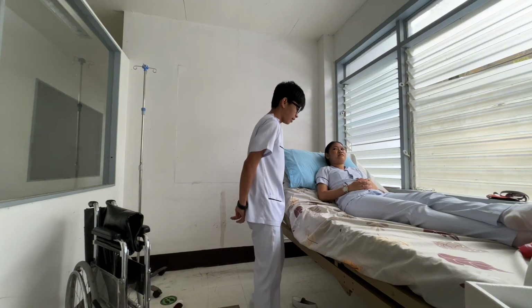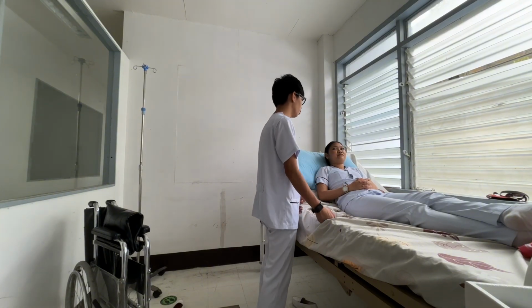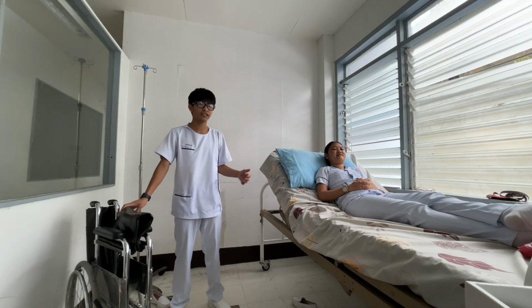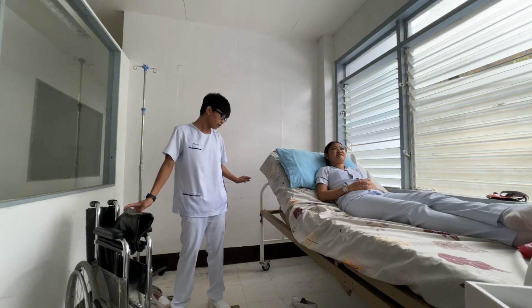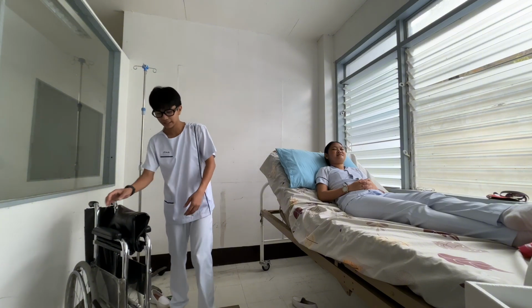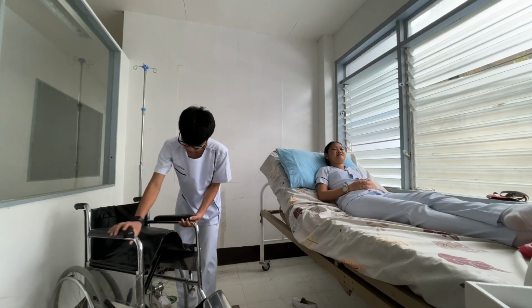So, assume that I have already applied the bed brakes. I will now apply the wheelchair brakes.